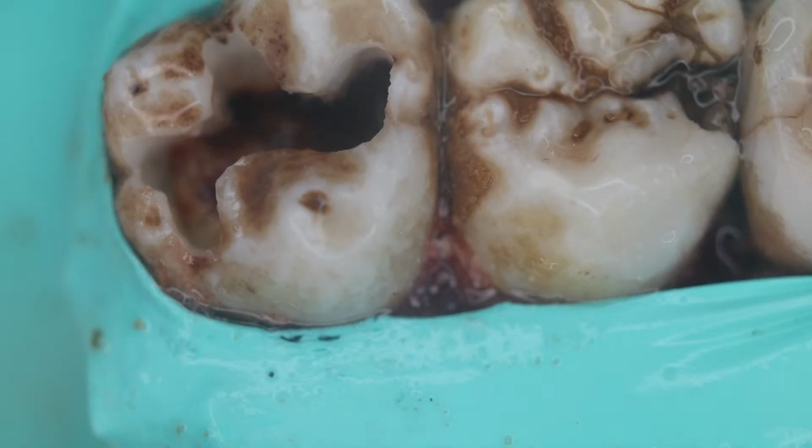So now what we can consider is we can take the straight fissure burr.